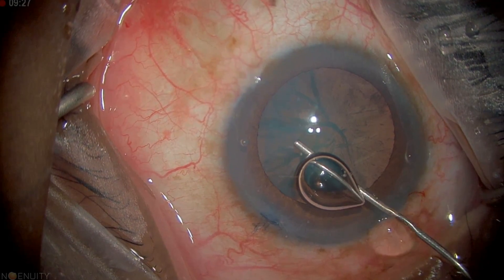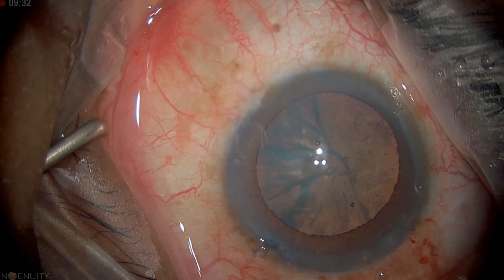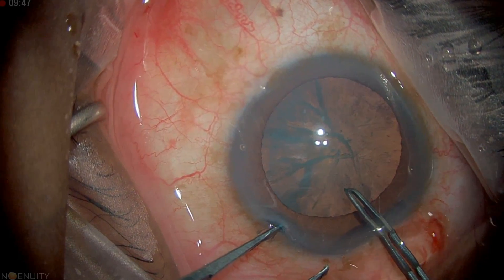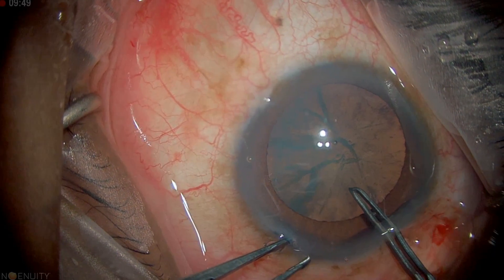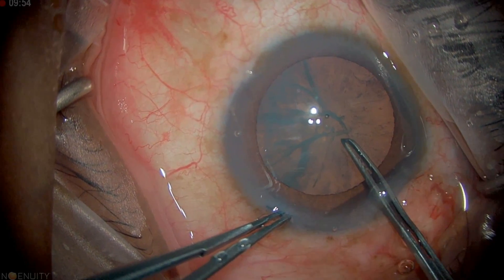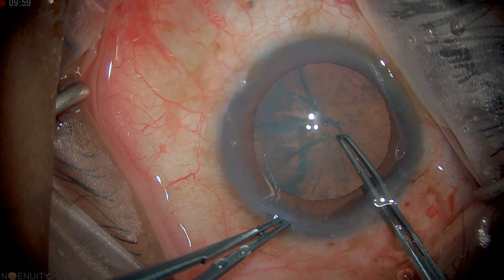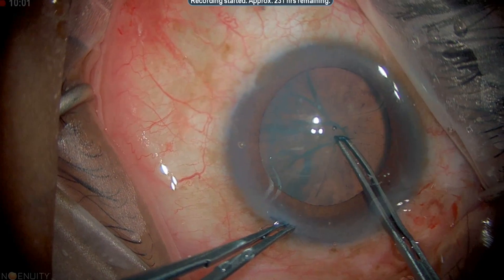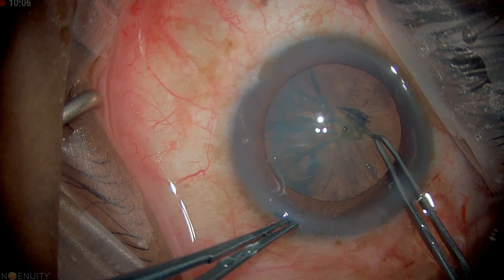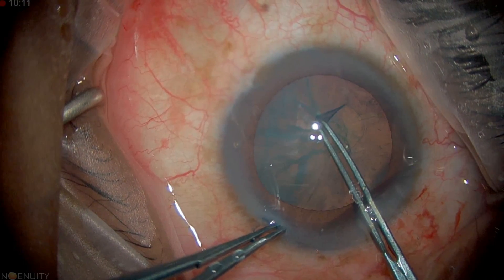I'm going to inject some viscoelastic behind it to clear it. I like to grab the wound for control over the eye. I would normally make my anterior capsulectomy with the cystitome instead of my knife, and then go just underneath the capsule. We're going to lift up a flap to about the diameter that we want and start our CCC.